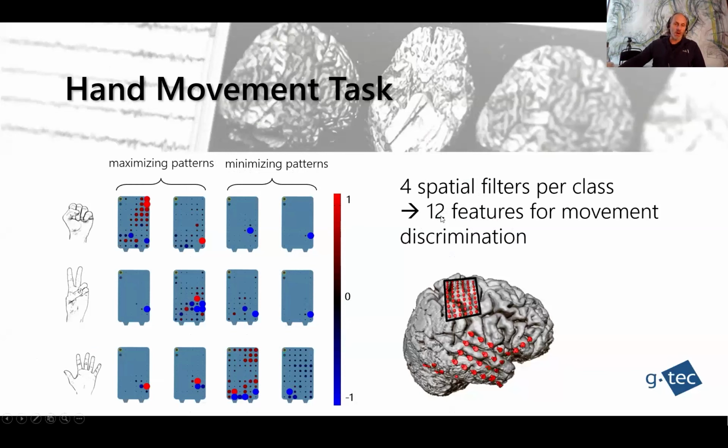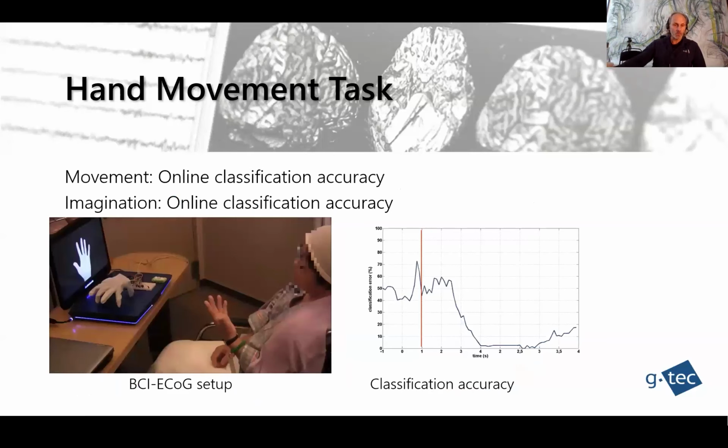And here's an example with a high resolution grid for a brain-computer interface experiment where we had the goal to control a robotic avatar. So to give a whole robotic human being back to a locked-in patient or a paralyzed person. This is a very nice experiment. The person is supposed to do exactly what's on the screen, like leave the finger straight, and the brain-computer interface controls the robotic hand. So she makes different gestures. I'm showing you the video here with real movements so that you can actually understand what she is doing.